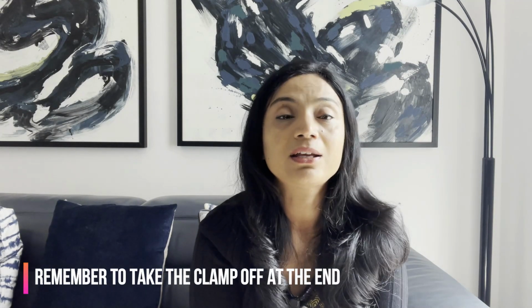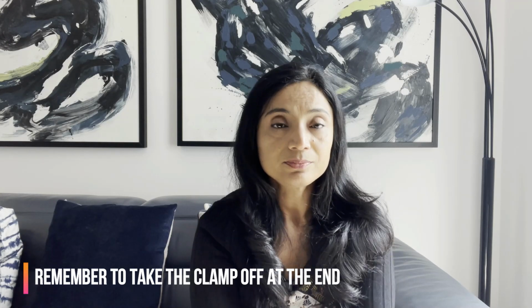Another one is make sure you take the clamp off at the end. Okay, this is a very common fail in this station, because if you don't take the clamp off, you're leaving your patient with urinary distension. Okay, so we can't do that. So this is a very common fail, make sure you take the clamp off at the end.